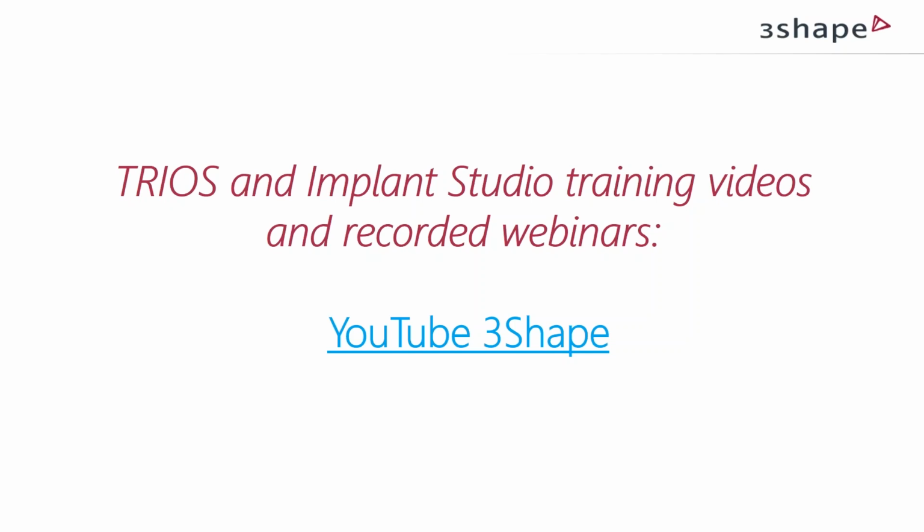We have a question about recommendation for 3D printers, Thomas. Yeah, so 3D printers, I guess that's of course when we talk about guides and guided surgery, that's of course a link into the workflow, and what we're seeing at the moment is of course a lot of things happening and a lot of buzz, I would say, about 3D printing, but there's no doubt that it's here for good now in dental. I think that's safe to say.